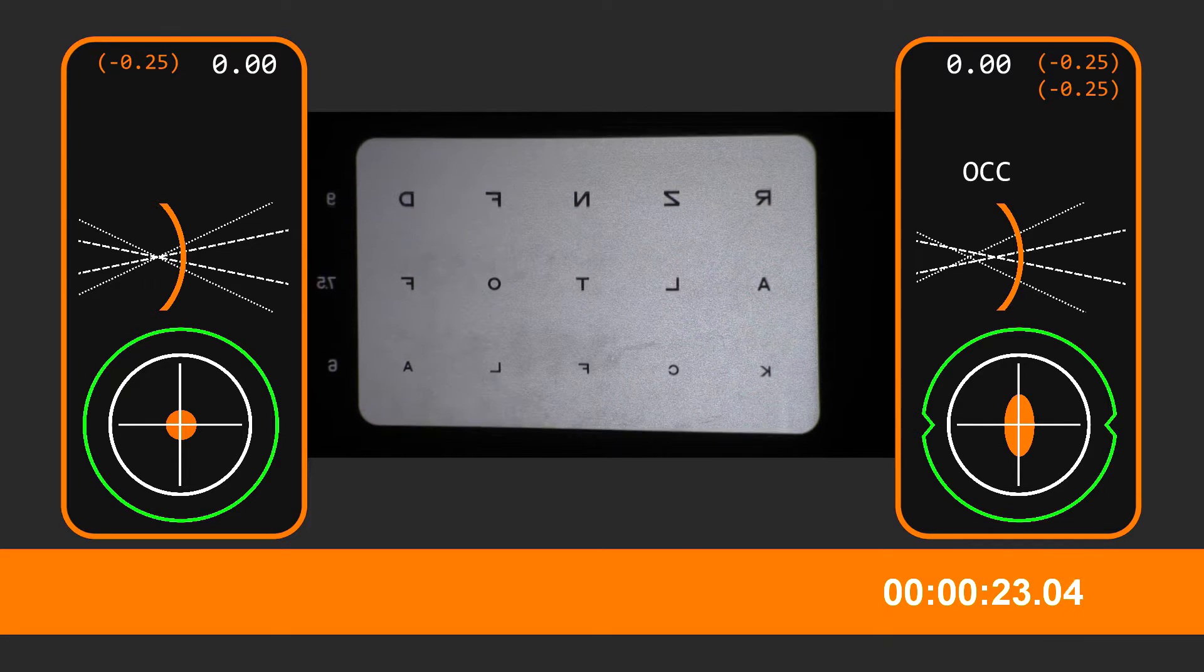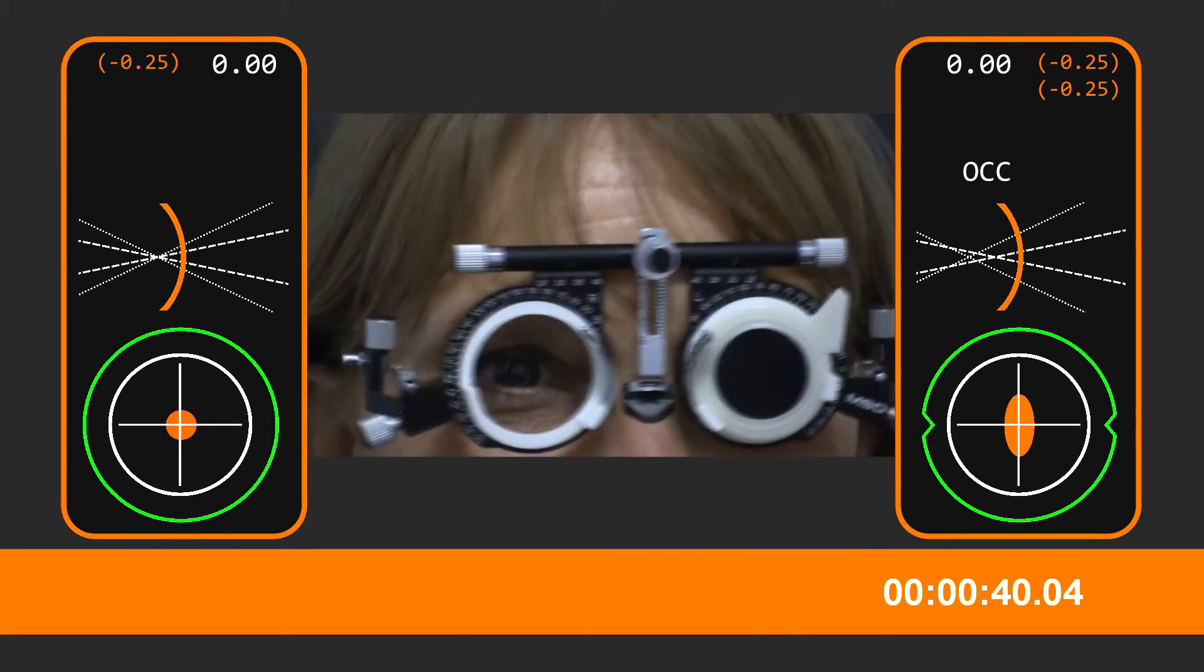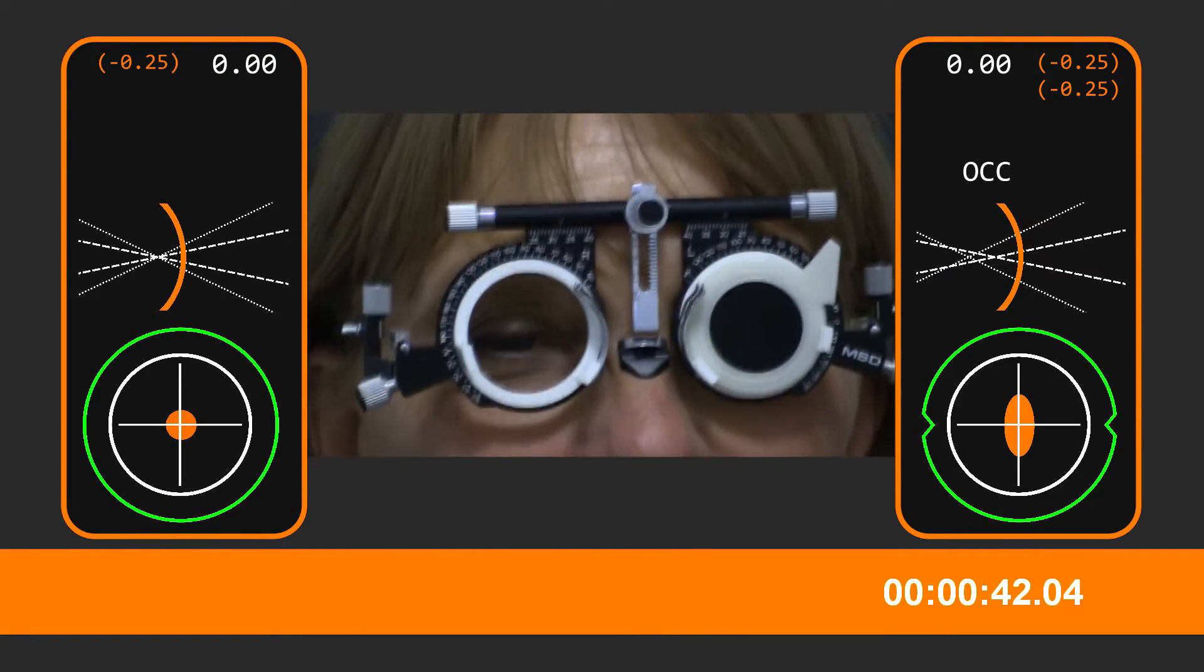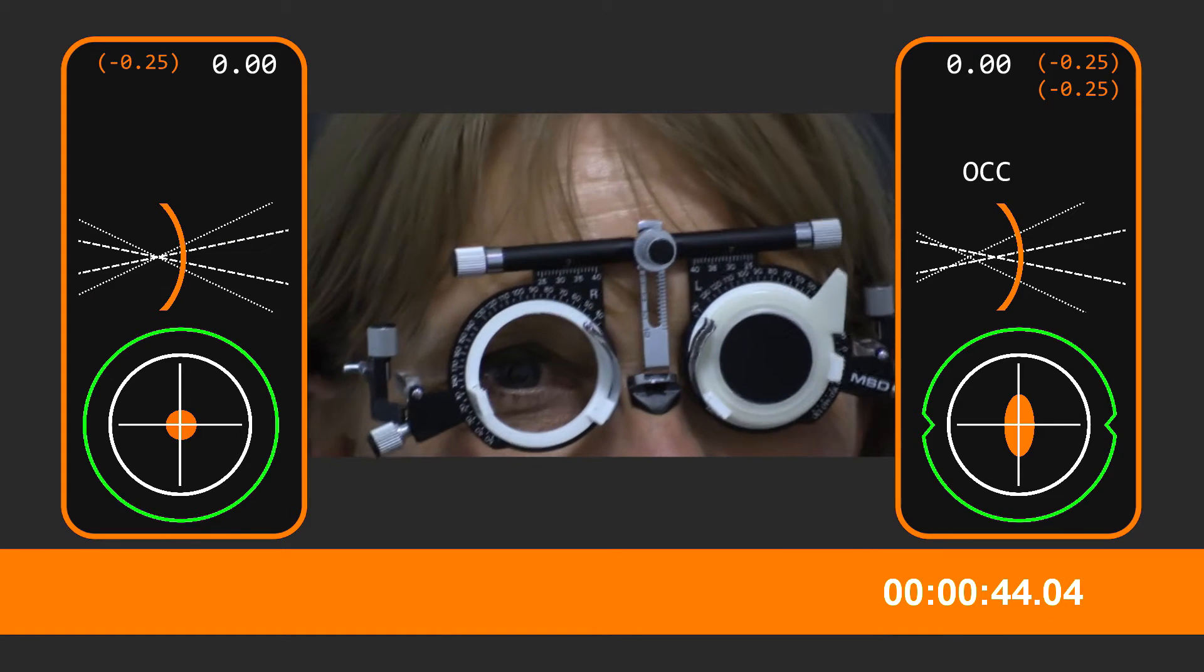Are they back to front? F, O, T, L, A. Oh, you're reading them that way? Yeah. Reading the other way, madam. Oh, I said F, F, D. I don't know why I did that. And then I was thinking they were actually in reverse, but it's because you're used to it. I'm used to doing left of the blanks. I'm doing the patient. That's right, yeah.